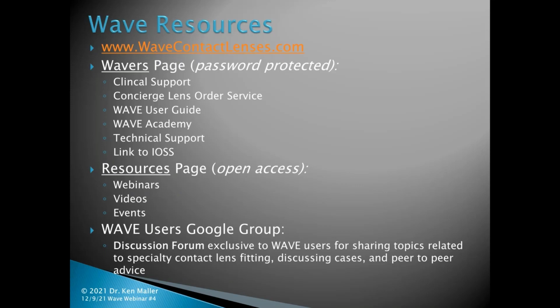Now, does that mean I always stop there? And the answer is no. Very commonly, I will go out a little bit further because I am designing the lens considerably larger, and I do want to know what's going on a little bit more peripherally. But for the purposes of demonstrating what's going on here, as well as my first initial assessment, it's typically done around that 7mm cord, because it's just a very easy place to get the reference data from.